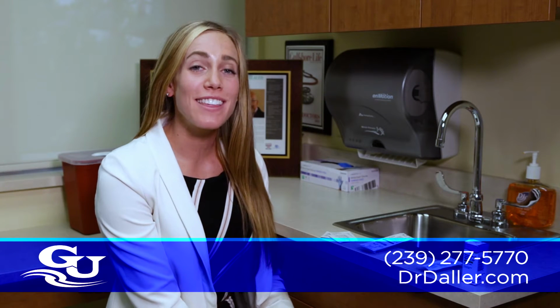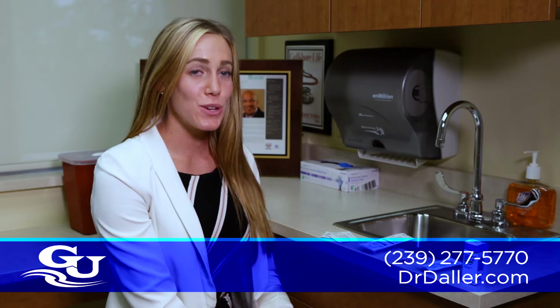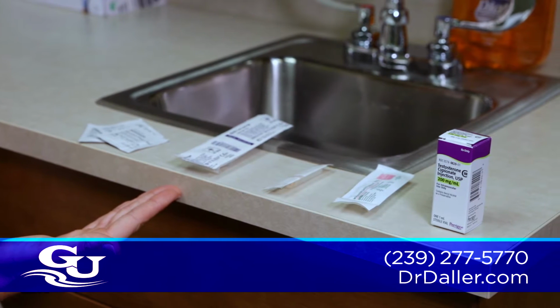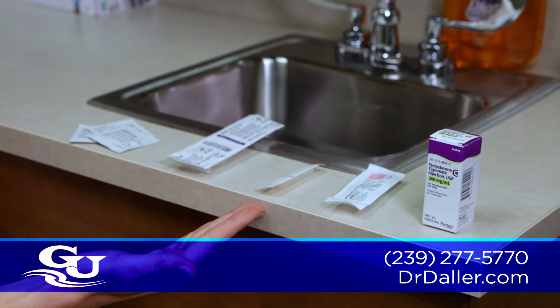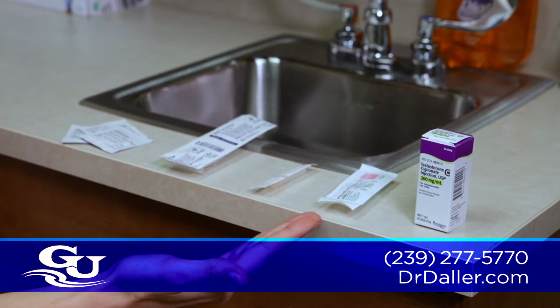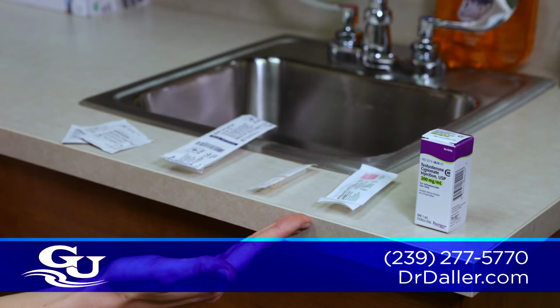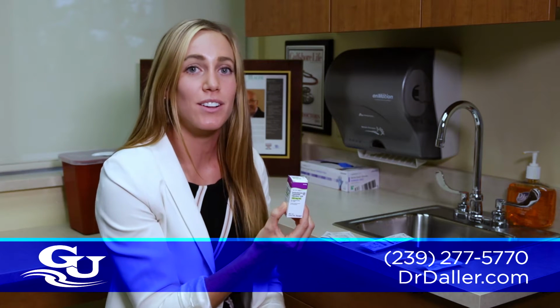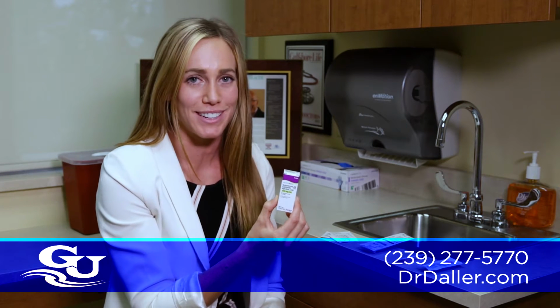We have laid out everything that you need for self-injection. You will need 3 alcohol prep pads, one 1 milliliter Luer-lock tip syringe, one 30 gauge by ½ inch needle, one 18 gauge by 1 inch needle, and your testosterone cypionate. This specific vial comes with 200 milligrams per milliliter.